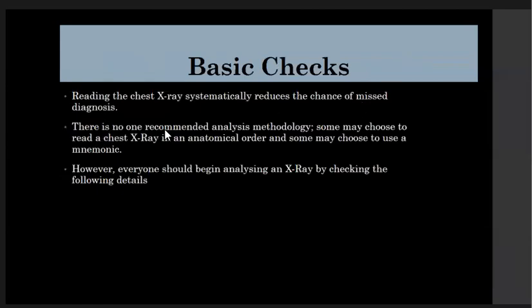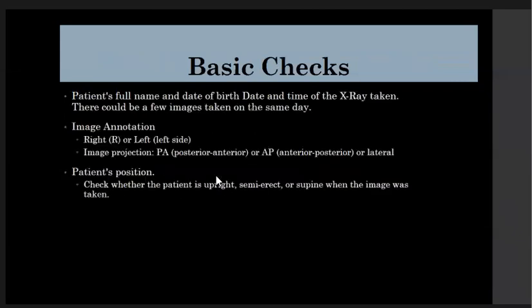There is no one recommended analysis methodology to follow. Some may choose to read the chest X-ray in anatomic order, and some others may choose a mnemonic. However, everyone should begin analysis by checking the following details, as we said at the beginning. Patient name; this is repetition, and repetition is good for memorization, as we say in Arabic: repetition teaches the clever ones.